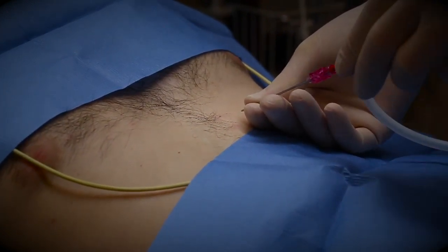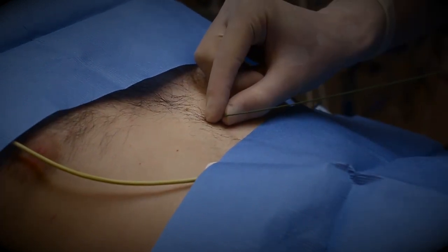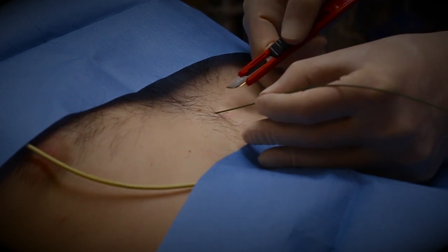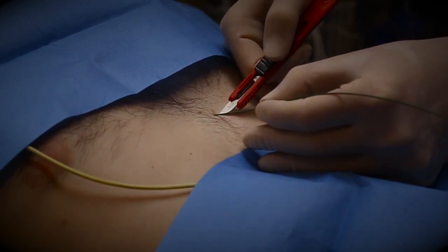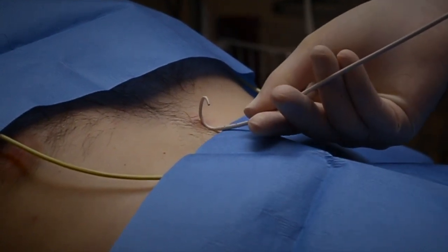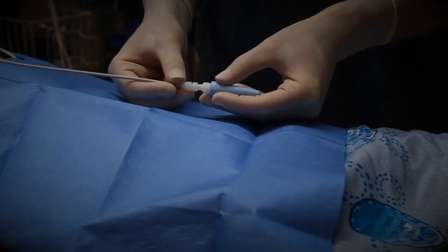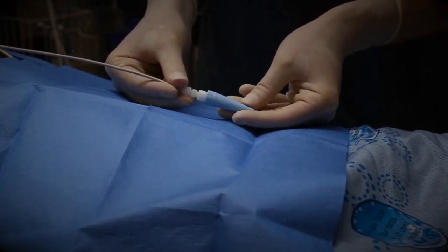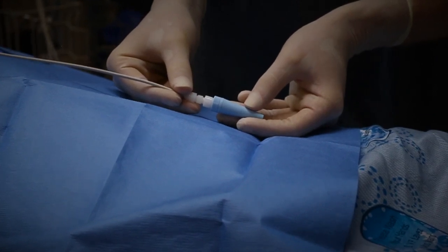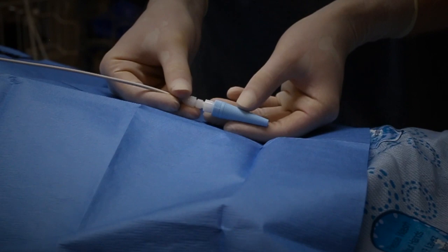If the patient is not in arrest, thread your guide wire through the needle and into the pericardial space. You may or may not be able to confirm the wire's location by ultrasound, but you should have an approximate depth based on your previous ultrasound findings. Similar to a central line, make a nick in the skin, advance the dilator, and insert your pigtail catheter. The catheter will curve when it's inside the pericardium — ensure all holes in the catheter have reached the pericardial space. Connect your catheter to a sterile collecting system. Draining 300cc should be enough to hemodynamically stabilize any unstable tamponade; do not drain more than 500cc at once. After draining 300cc, continue with your resuscitation.